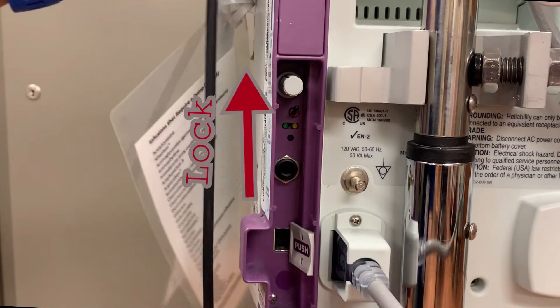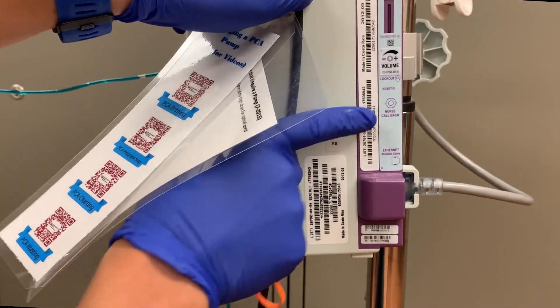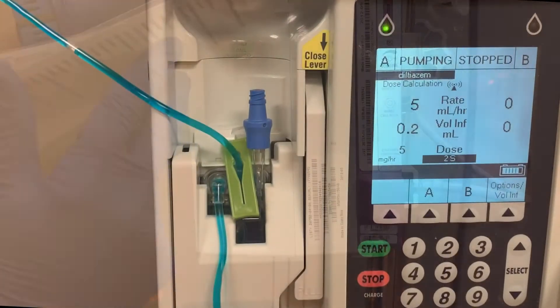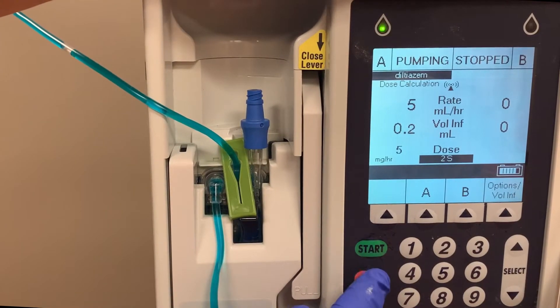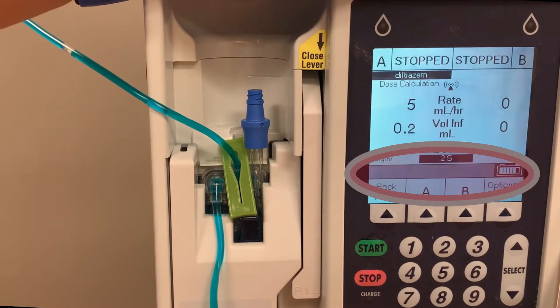Flipping the switch up will activate the lock. On the side of the pump, a label explains these controls. With the hard lockout enabled, any button pressed on the keypad will not function, and hard lockout violation will display on the screen.